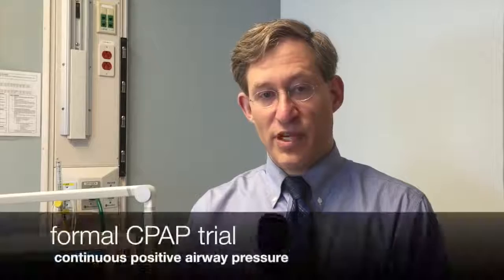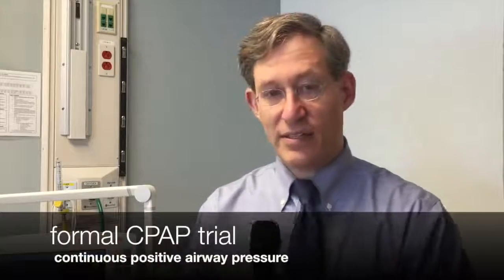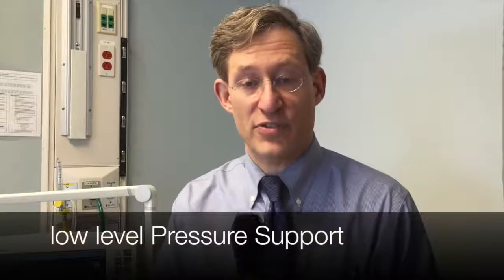Continuous positive airway pressure can be set on the ventilator, and the idea is, as I've been taught, this is like sticking your head out of a car window going 50 miles an hour. The machine isn't trying to determine when you're breathing in and out, it's just there to keep a certain amount of pressure at the mouth. This is another reasonable way to do it. The most commonly used approach, at least in this intensive care unit, is low levels of pressure support.